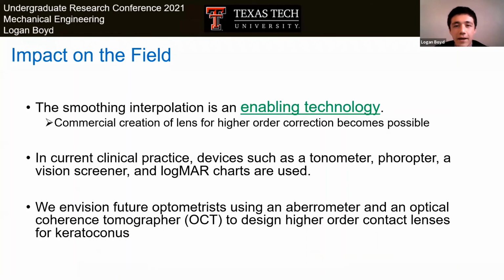Let's talk about the impact on the field. Like I mentioned beforehand, higher order control really isn't possible until you have a method to smooth the corrected and uncorrected portions of the lens. Without that interpolation, commercialization is impossible because the lens is not safe. So this interpolation method really is an enabling technology.